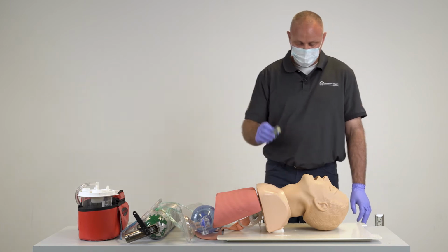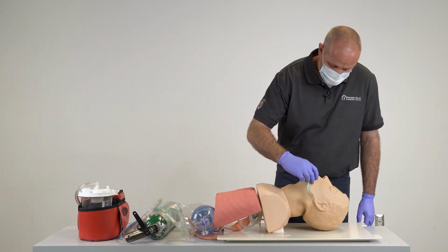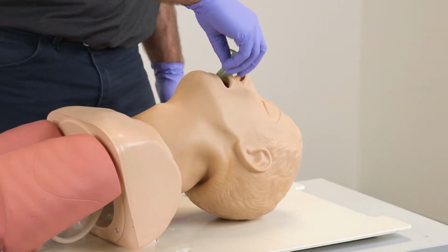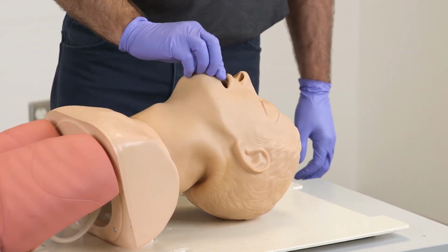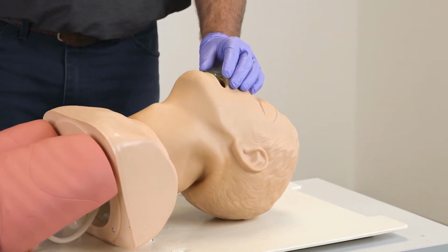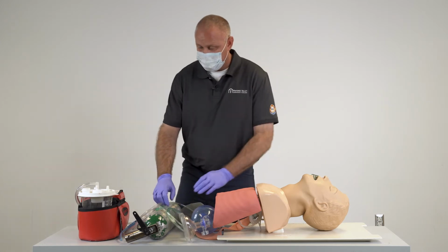Okay, at this time I'm going to place an OPA, appropriate size from the corner of the mouth to the earlobe. Insert it backwards, rotate it 180 degrees. Does my patient accept it? There is no gag reflex present, and the patient accepts the airway adjunct. Okay, good. This time I'm going to bag my patient.